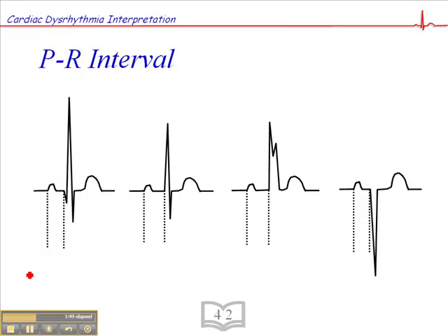The QRS morphology may be a little different in certain rhythms. In this first example, we calculate the PR interval based on the onset of the P wave to the onset of the Q wave, because there is a Q wave in this case. In this second rhythm there isn't a Q wave, so we measure from the beginning of the P wave to the beginning of the R wave — in other words, the beginning of the QRS complex.